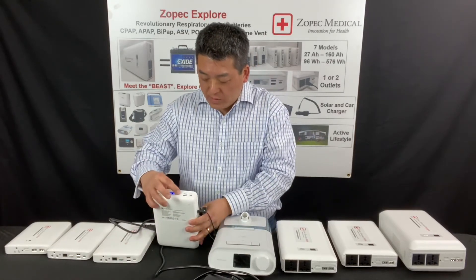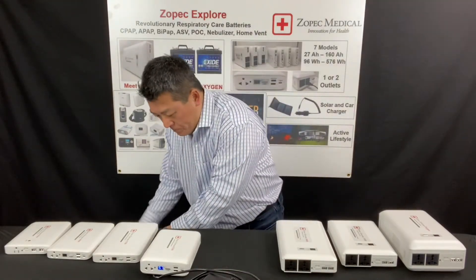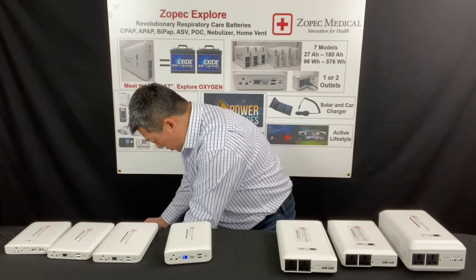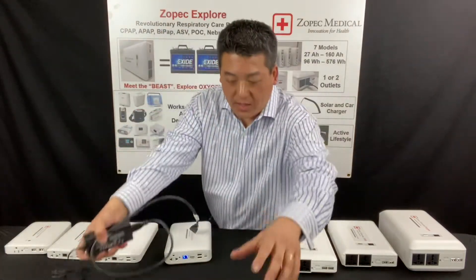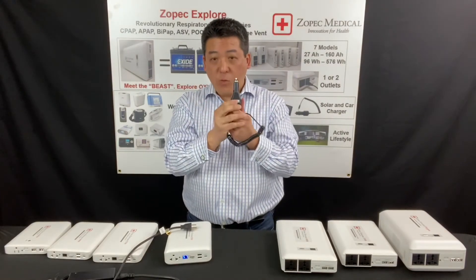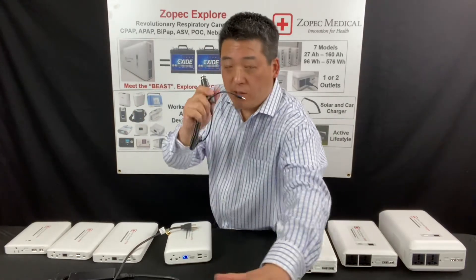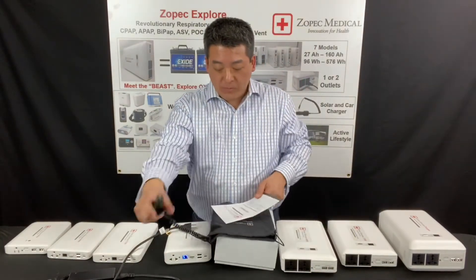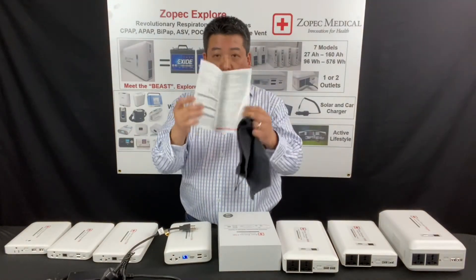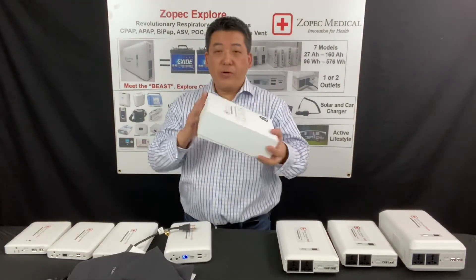What do you get with a Zopac Explore CPAP battery? Every battery comes with a wall charger, as I just showed you. It comes with a car charger — 45 watts — which will charge just as fast as charging from the wall at home. It's a DC 45-watt fast car charger. It comes with a user manual that has details about how to run with your CPAP, a protective pouch, and a very nice storage box.